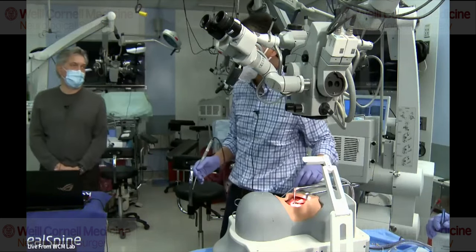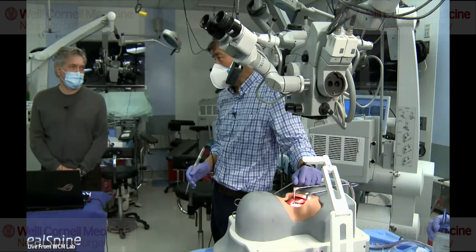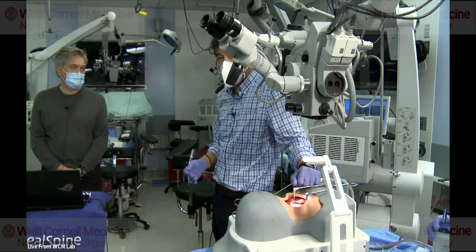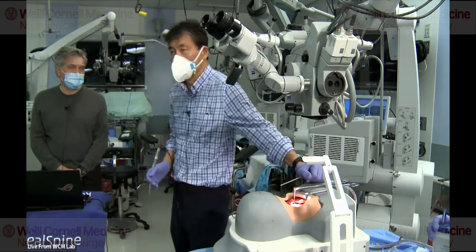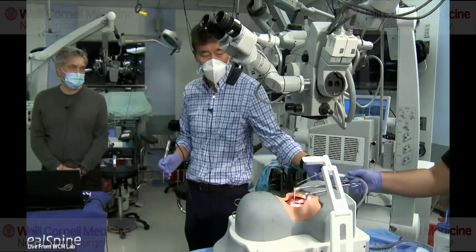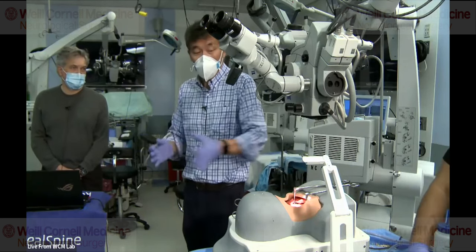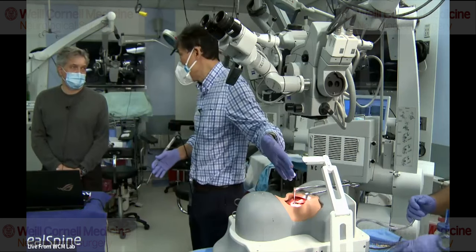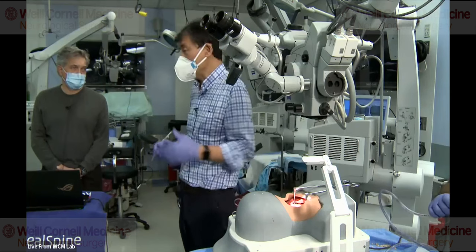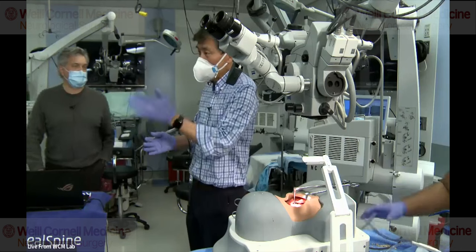The last posterior infection I had was about maybe 1,800 cases ago, and it was in 2005. So I don't worry about infections, because it's not just the vancomycin and Ansep. When I was doing my own closures, I would put in 150 sutures and it would take me 45 minutes to close this wound. Now I have the plastic surgeons do it, and they do a similar thing where they spend a lot of time and use a lot of sutures, so there's no dead space. And then they leave a drain in for a week.